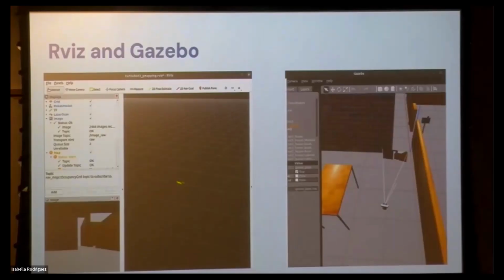There you can see a little robot driving around a test environment, and it handles collisions, joints, all that stuff. RViz on the left is the robot visualizer, and it handles the more nebulous aspects. In the bottom left, you can see the perspective of the robot. RViz handles the mapping and the localization aspects.